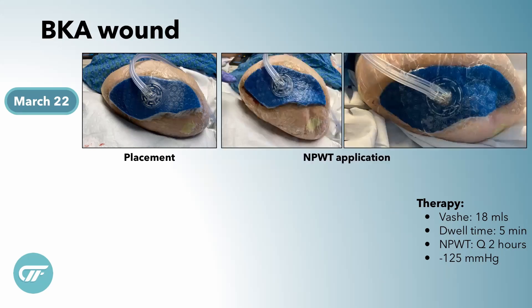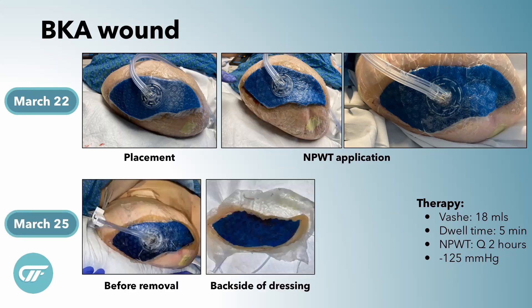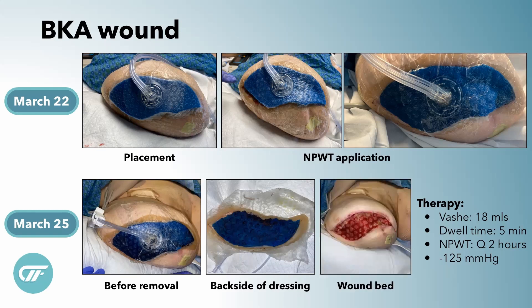Once we deploy it, it kind of goes down a little bit, but it has a pretty strong tension to this foam. You don't need a ton of fluid — we only put 18 mils in for this dressing. This is what it looked like before we took it down. I always like to check the back of the dressings to see how things look, if there are any leak points. And look at how beautiful his wound looked — pretty cool.